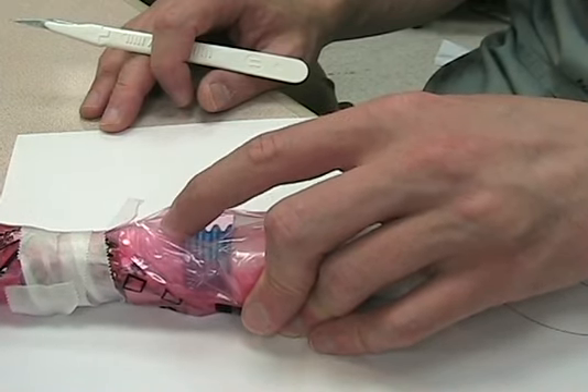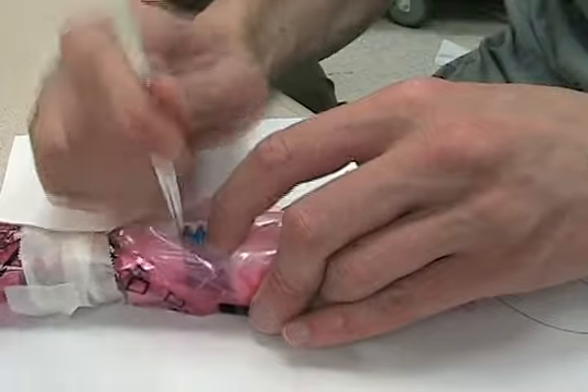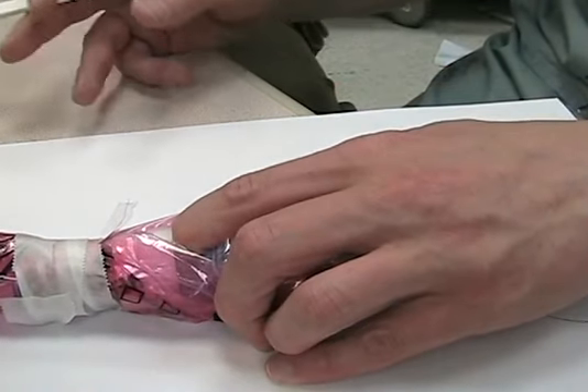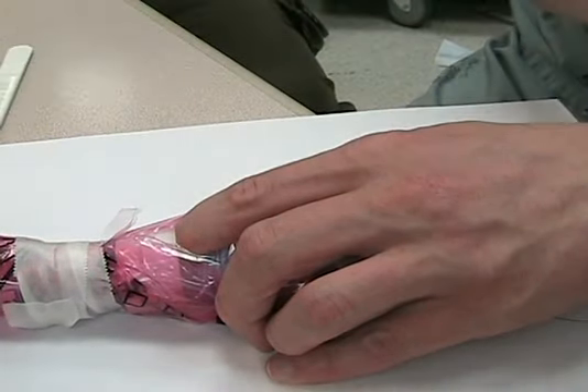Once you find the membrane, right above where the cricoid cartilage is, you're going to make an incision horizontally. Make it through the full length of the membrane. Now get your finger inside the trachea. I have my finger just above the cricoid cartilage inside the trachea, and my finger's not going to leave there until I get something else in.